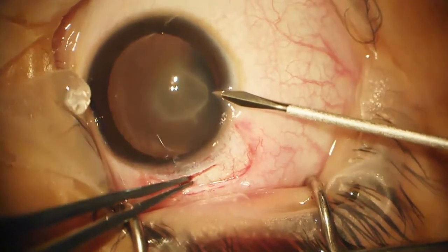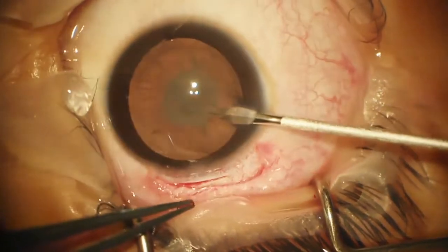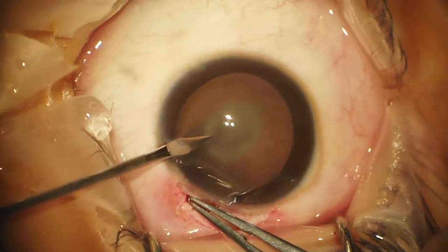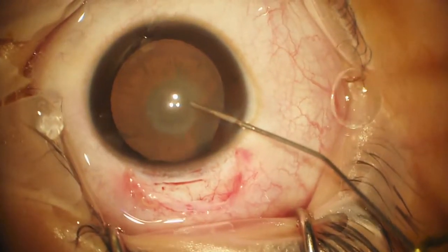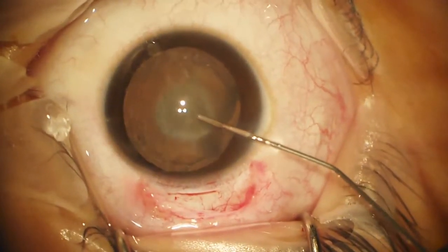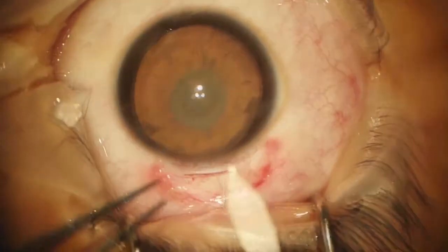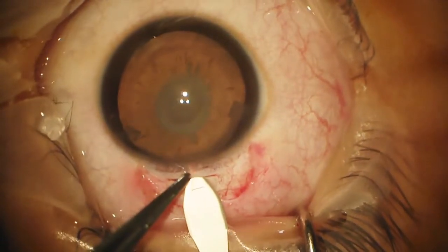I'll make two side ports. We may use bimanual. This isn't going to require much phaco energy because it's going to be a very soft lens. I'll take the viscoelastic — this is Viscoat — and now we'll enter the anterior chamber with the keratome.